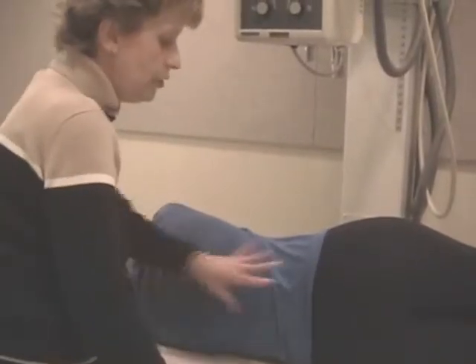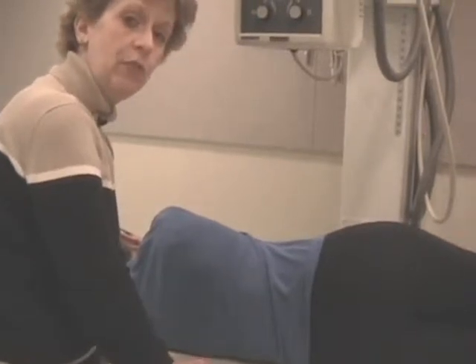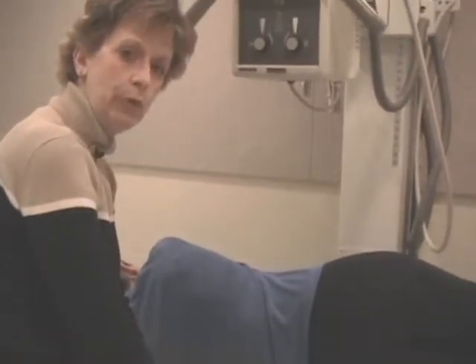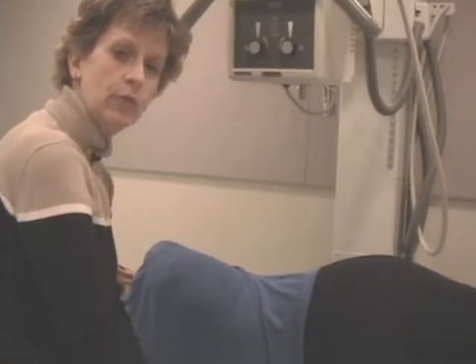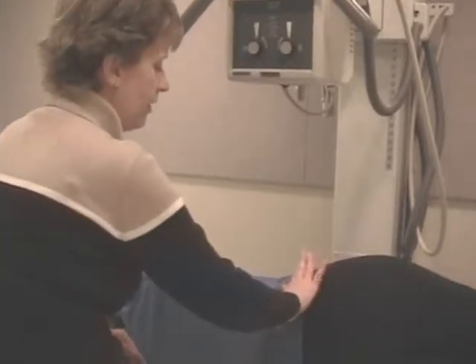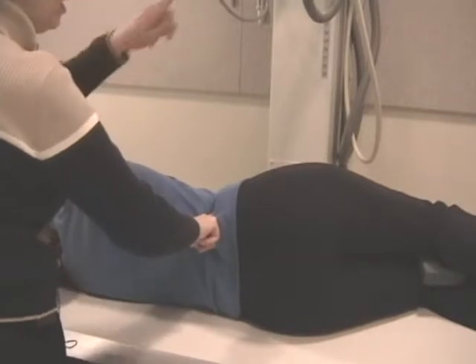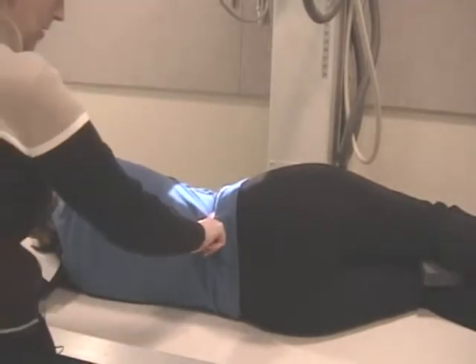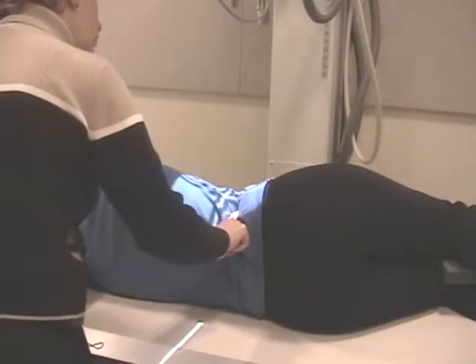Okay, I've got the patient straight. I've got her in a true lateral position. And your part film reference points are mid-coronal plane to the center of the film, and the center of the film is 2 inches above the iliac crest. Okay, so I'm going to find the iliac crest, feeling on the posterior wall. There's the iliac crest. I want to be 2 inches above the iliac crest with the mid-axillary line to the center of the film.